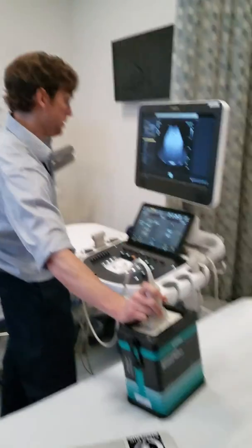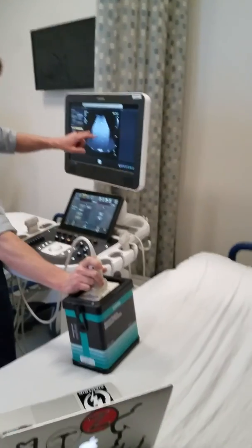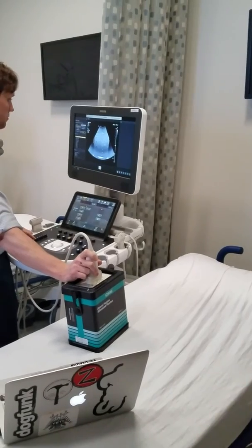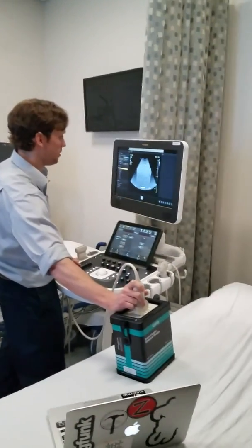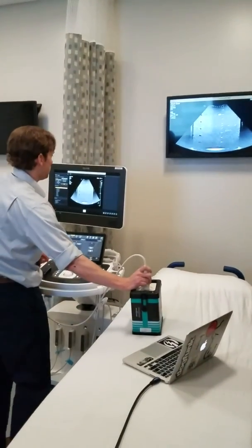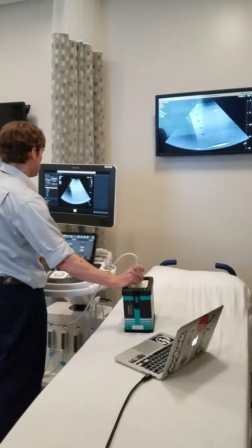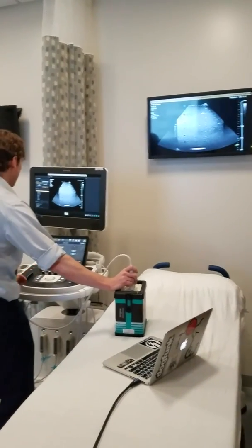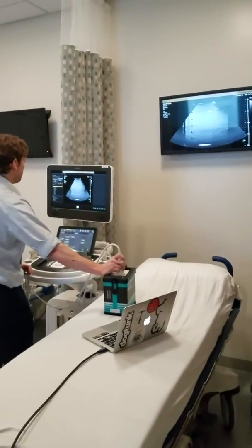Here you can see it looks pretty uniform. In most areas there's not really — the reason it obviously has a little bit lower signal here is we can use the time gain compensation to try to alleviate some of that non-uniformity. I don't really see any non-uniformities, there's no issues, no radial lines dropping out on any of it. And now we'll look at depth of penetration.